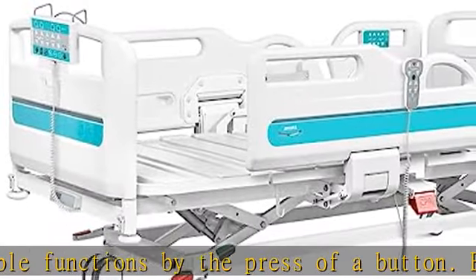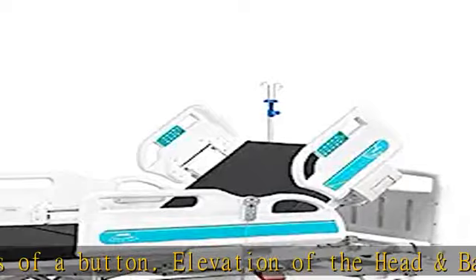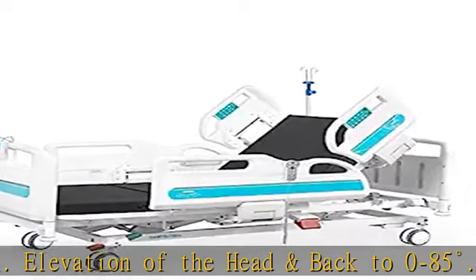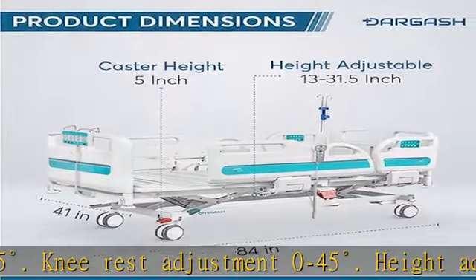Height adjustment can be lowered to 13.7 inches and as high as 31.5 inches, excluding the mattress height. Trendelenburg position 0 to 12 degrees, and reverse Trendelenburg 0 to 12 degrees.